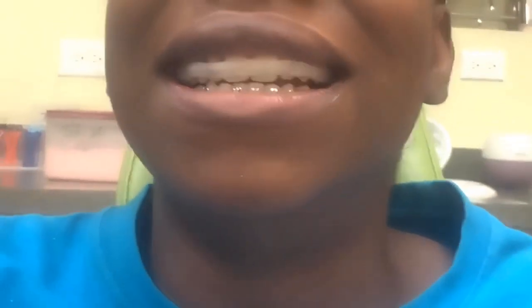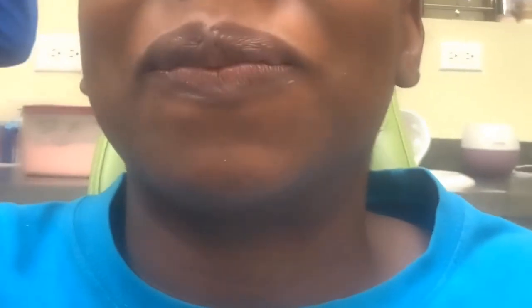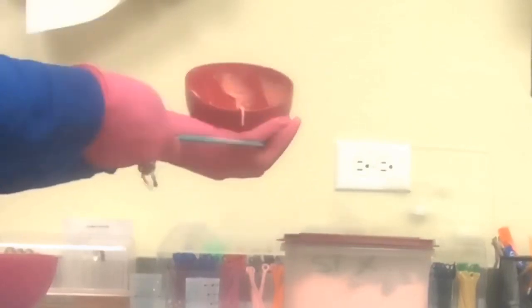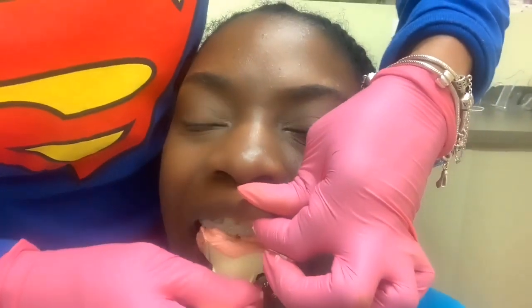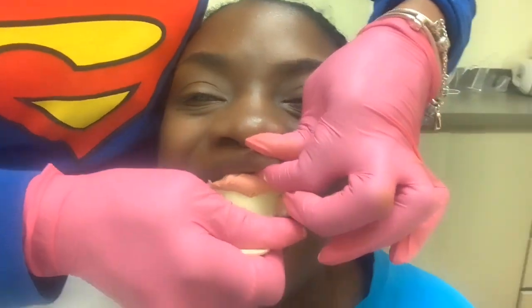So she said okay, she went in a bag, she cut it, and then she tried again, and then it actually didn't hurt. Thank God. So now she's just going ahead and mixing the paste, and then she's putting it back into the tray, so that I will get an accurate impression of my teeth, so that the retainers could be created.